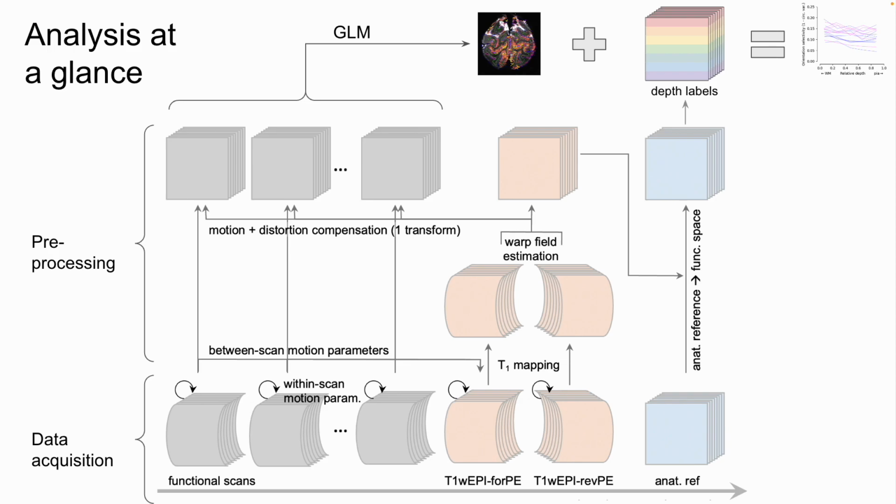At first, Camille Uludog shared with us a work in progress, and that was when we had an older scanner, and that died with the older scanner. Then on our newer scanner, we were lucky enough to have a CMRR. Eddie Auerbach was like, sure, I can put a T1 into your regular old EPI. So now we just have a little tick box to put in an inversion pulse with a specified inversion time. I'll talk a little more about that in a second.